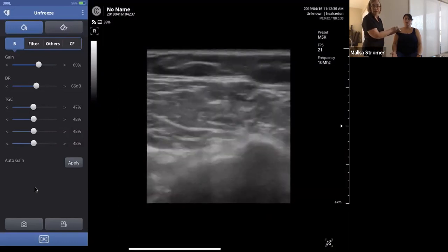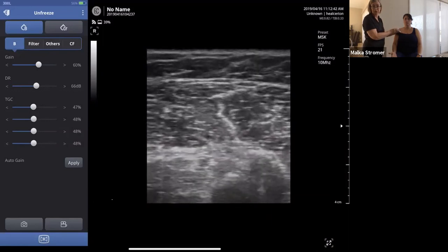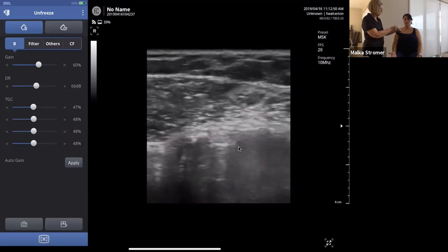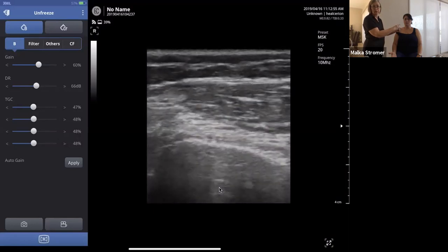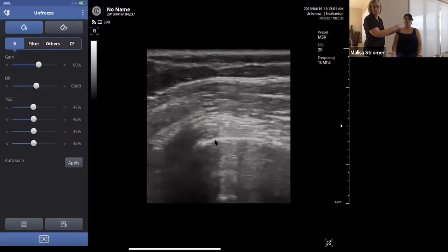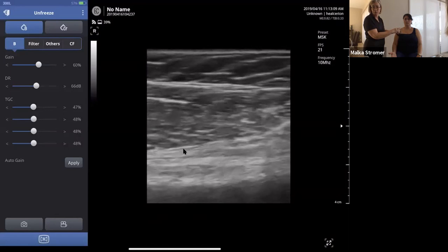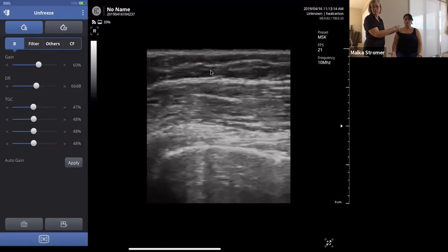So we're going to scan down through this distally to the pectoralis major attachment. Go up a little, right through there. And then back up to the short axis. I'm going to rotate the transducer 90 degrees. And now we have a long axis view of the biceps tendon. Humerus and biceps tendon just above it. I'm going to track that down. Tendons and ligaments look like rope. They're long fibrous structures. Deltoid muscle above that and skin surface.